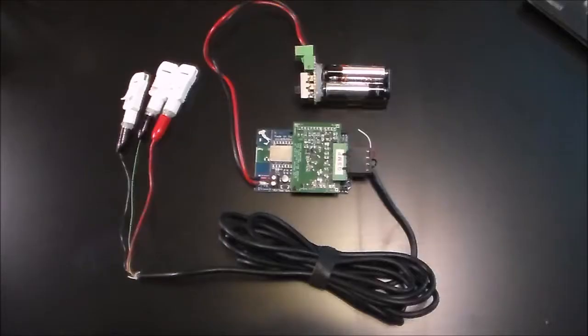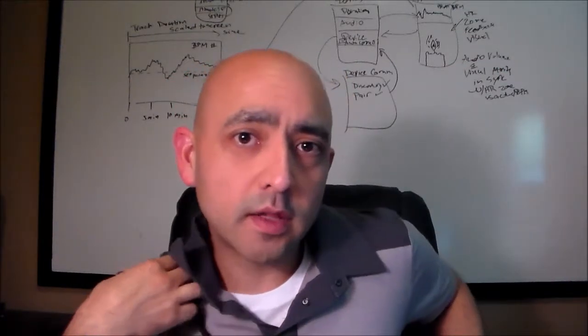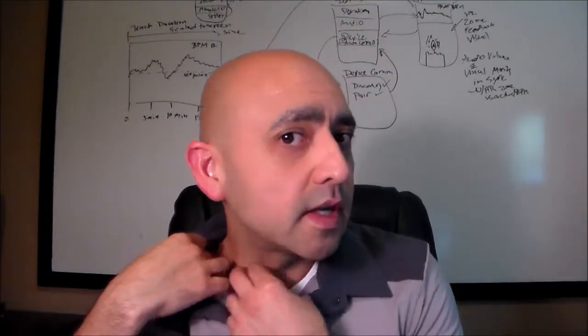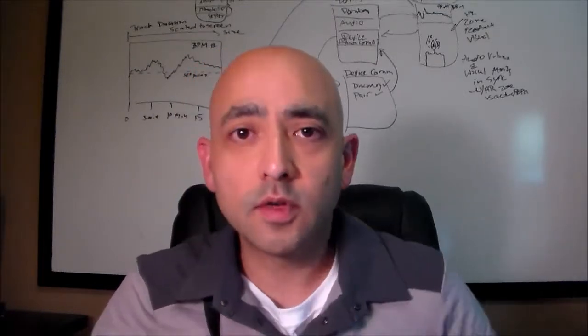Add a battery pack for power and we're all set to begin signal acquisition and stream the sampled EKG data to the smartphone. I've got all the electronics for the Holter monitor packed here in this over-the-shoulder bag. It's going to allow me to go about my business while the EKG data is streaming. I've got the leads connected to some industry standard stickies here across my chest.